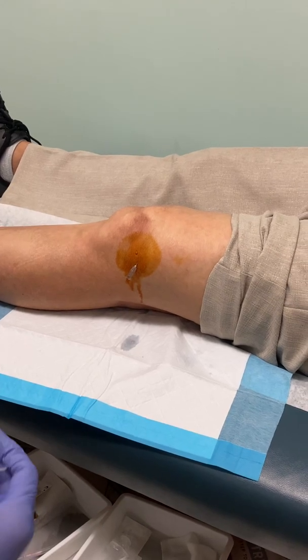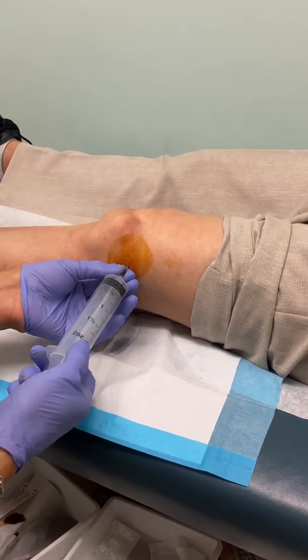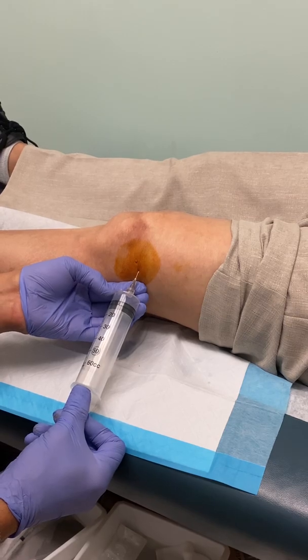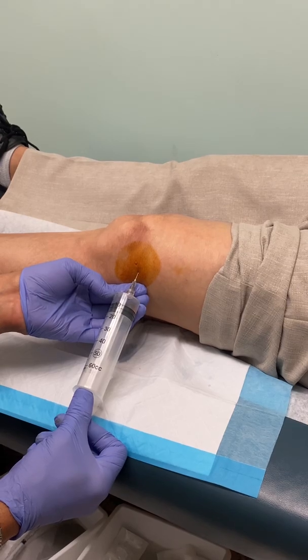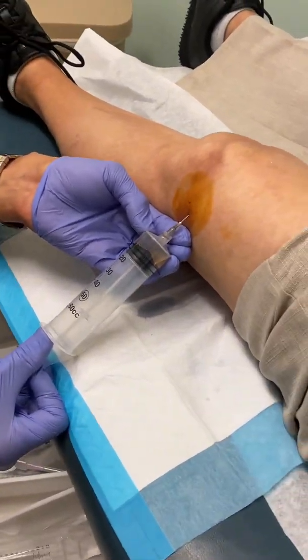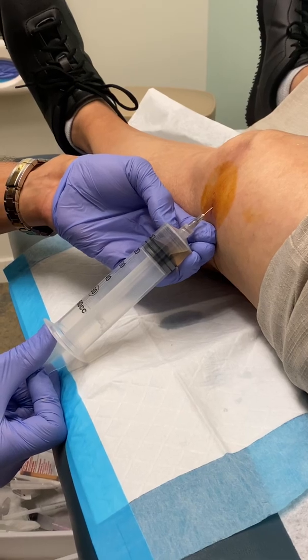In this case I'm actually aspirating. I'm not going to inject anything here, most likely. 22 gauge needle — I've got a big syringe in here. It's going to take a little while, but you're going to see the fluid. Once again, if you can look from the head, you'll see some fluid coming out.